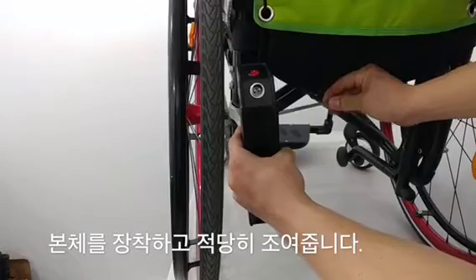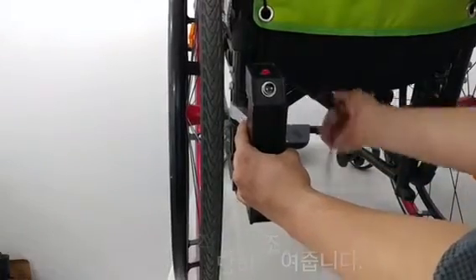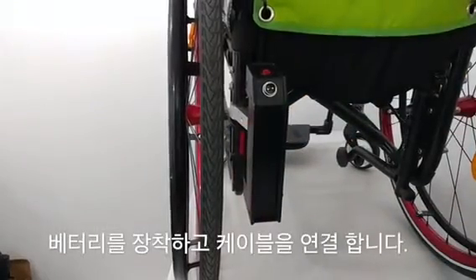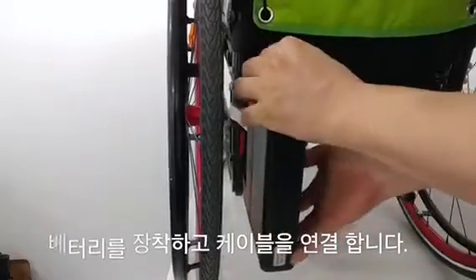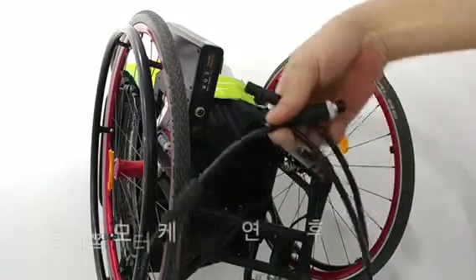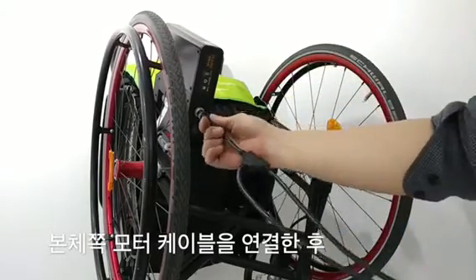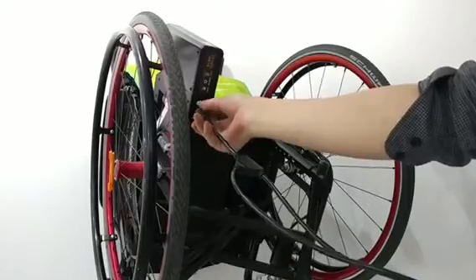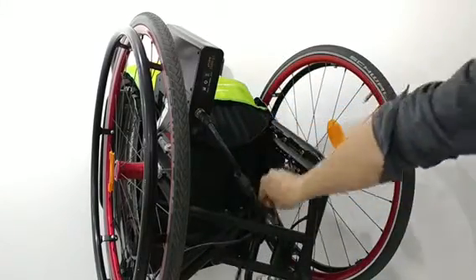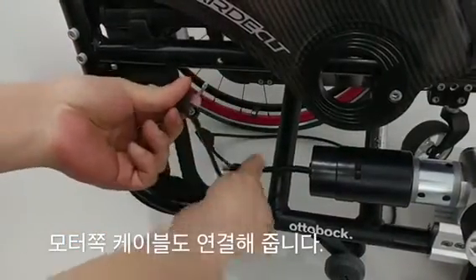Install the body and tighten it appropriately. Slide the battery in and connect the cable. After connecting the motor cable with the main body, connect the other cable with the motor side.